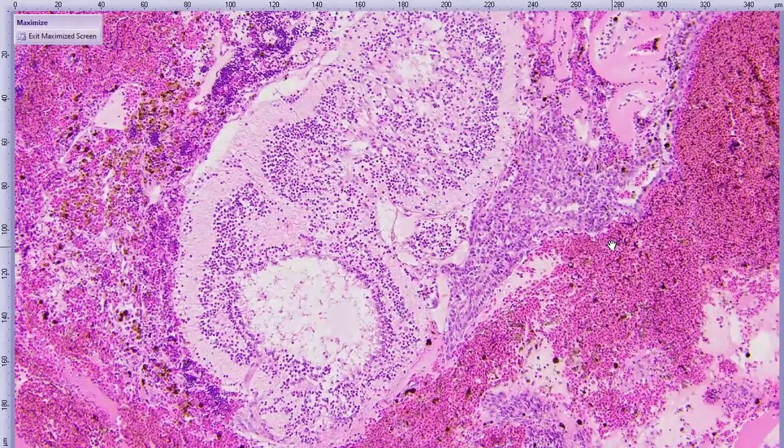So it implies retinal detachment and tear. We also have quite a bit of hemorrhage and inflammation inside this eye. So long story short, it's likely that this eye experienced trauma at some point in addition to the tumor. It's unclear if it was trauma after the eye was already blind, or trauma and tumor, or what relationship these things may have had. But interestingly, there's histologic evidence of trauma accompanying this.